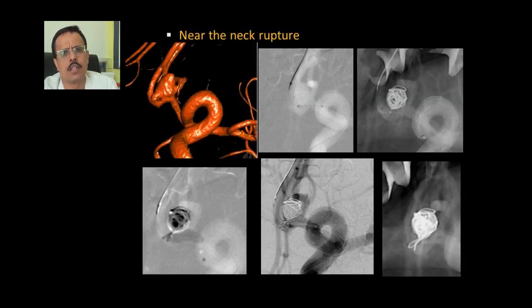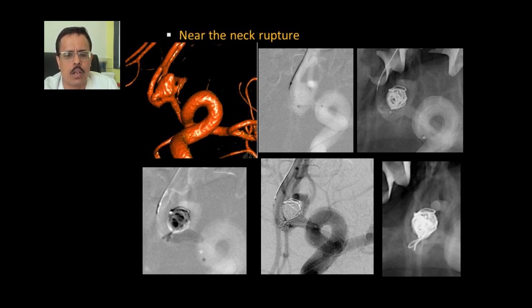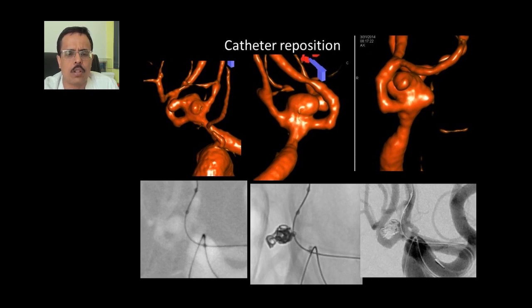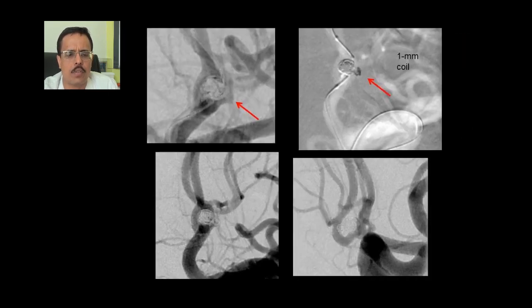Another scenario is near-the-neck rupture. This patient had a broad-neck anterior communicating artery aneurysm with a near-the-neck lobule which is probably the rupture site. In these cases, we always use a balloon placed in the right ACA. We start with coiling and ensure that some coil loops go into these lobules for a good outcome. Sometimes we reposition the catheter to reach all lobules. In this multi-lobulated anterior communicating aneurysm, balloon-assisted coiling left a very small lobule remaining, so we took a microcatheter to that part and placed a 1 mm coil, resulting in absolute complete reconstruction.